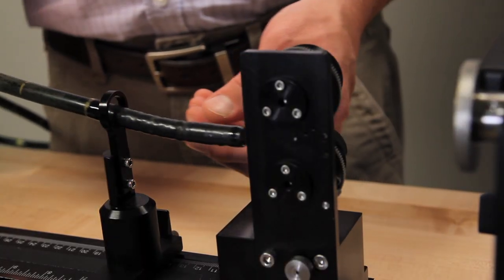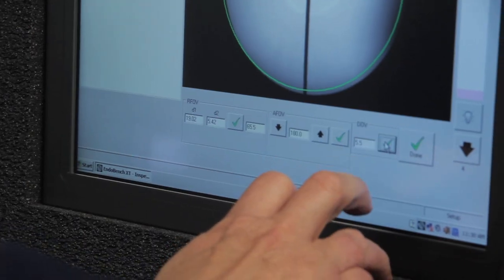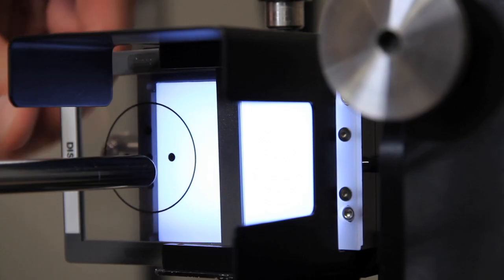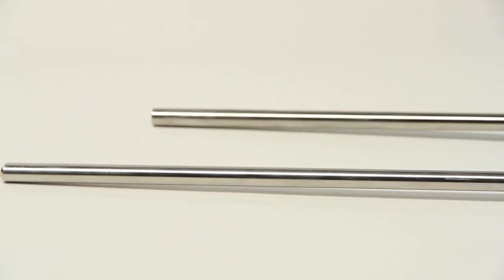When the scope comes back from repair, the technician can make a quality measurement of the scope and compare that to the baseline measurement of the scope. Therefore, the technician can have confidence that the scope has been repaired properly and can be returned to inventory and be ready for service.